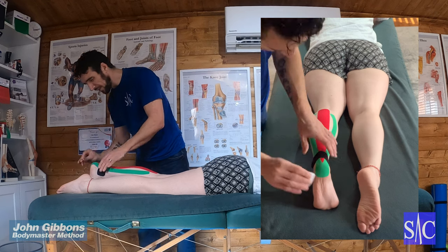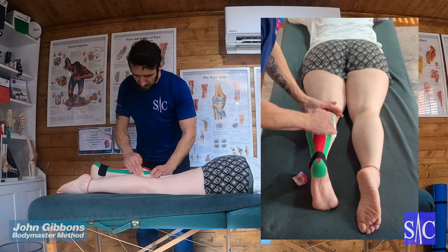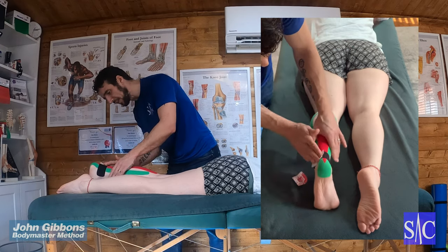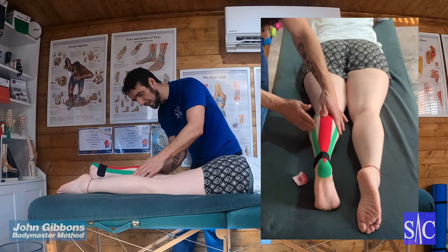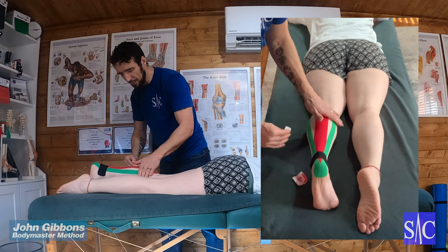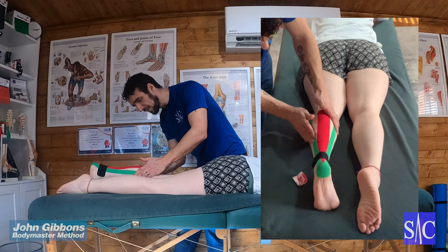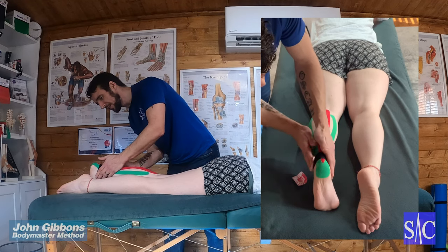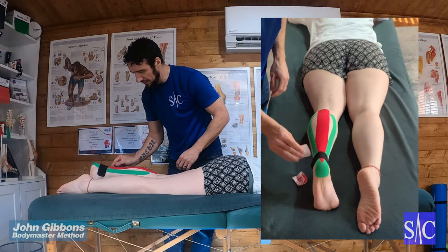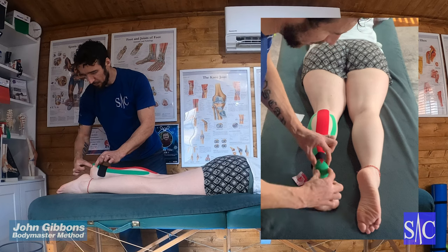Using the printed side of the backing, rub it down to activate the glue. It's a heat-activated glue, so do not artificially heat it with a hairdryer — you'll cause the glue to melt. Let it dry naturally. Pat it with a towel rather than rubbing it up and down, and the tape will last a bit longer. Any itchiness means you're having a reaction to the glue — remove it straight away. Otherwise, you should get about three to five days out of this taping. This part tends to come off first because of standing water in the shower.